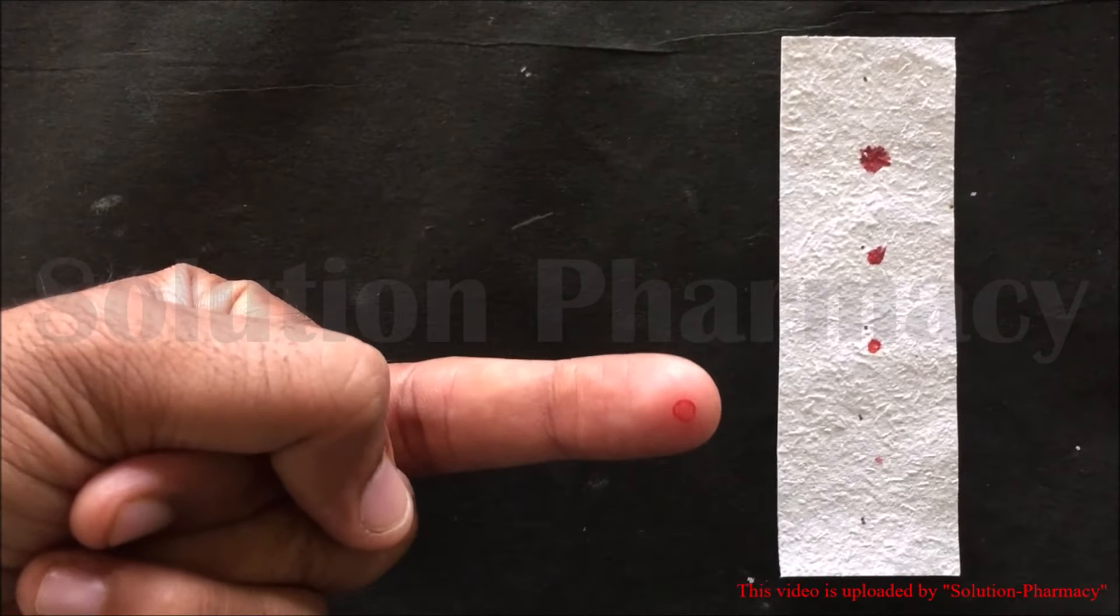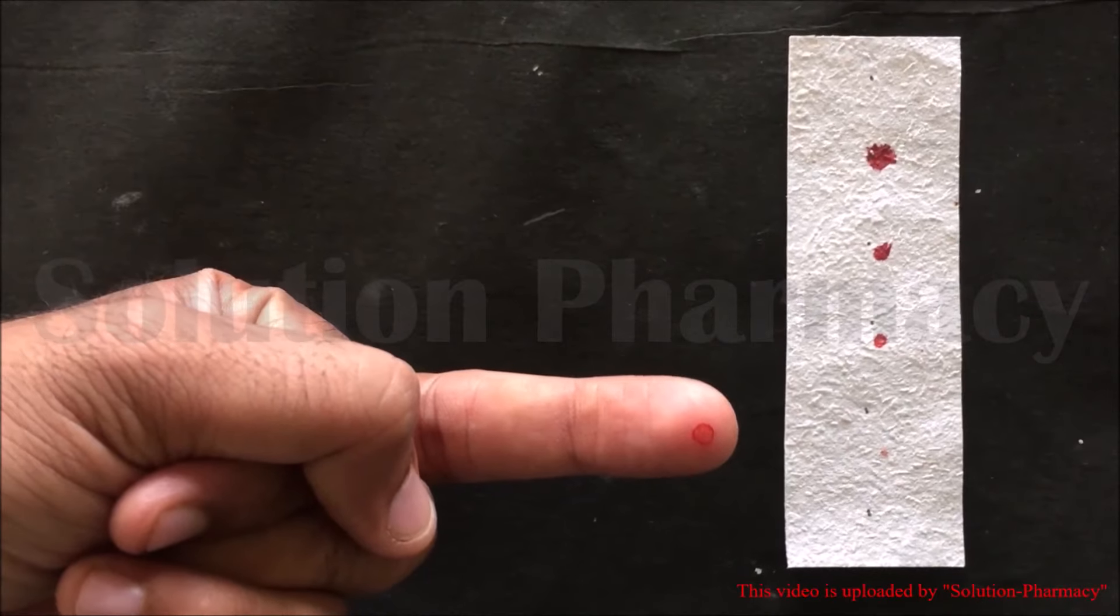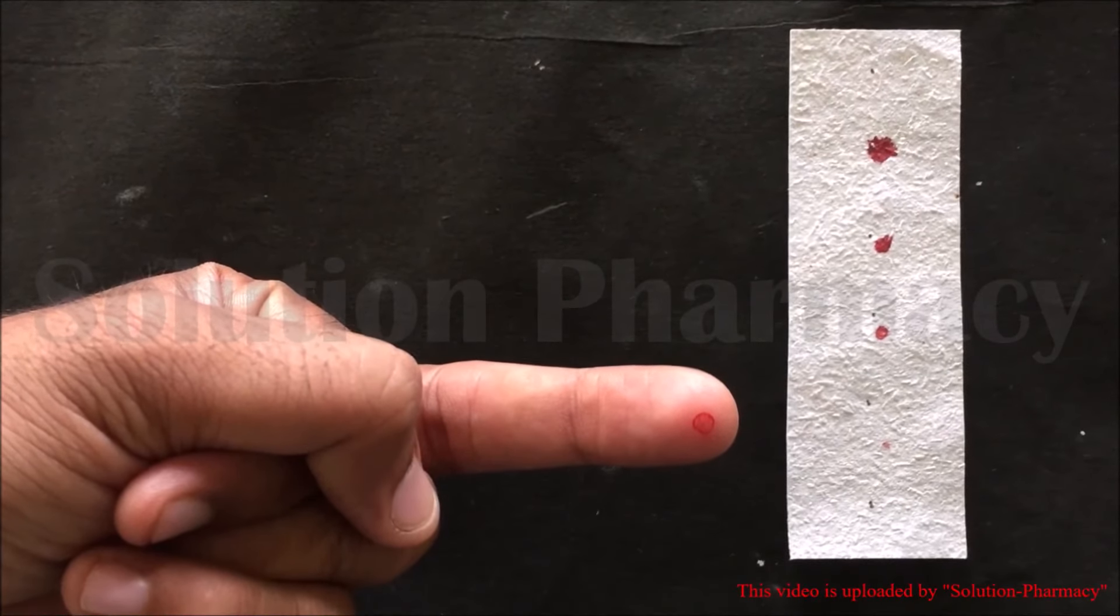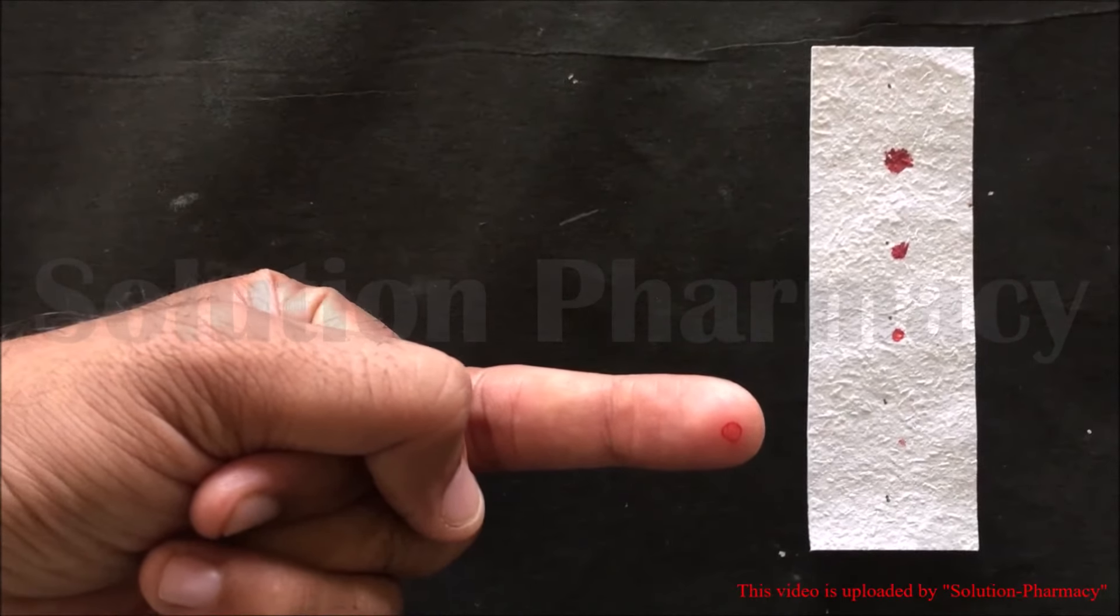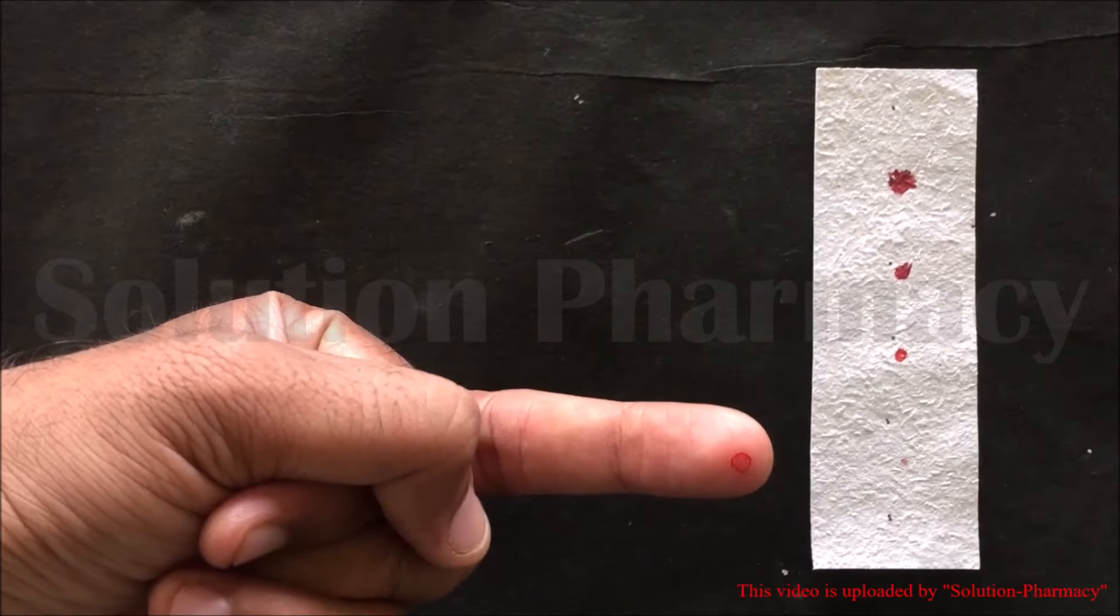Bleeding time is the time interval between the onset of bleeding till the spontaneous stoppage of bleeding, means blood stops to flow. Bleeding time is usually between 1 to 5 minutes.